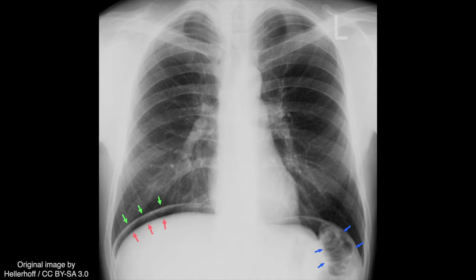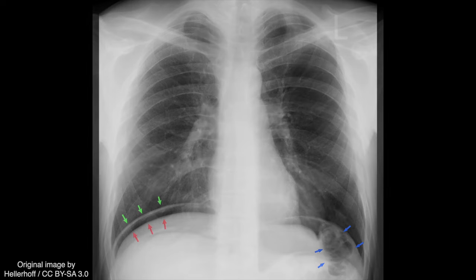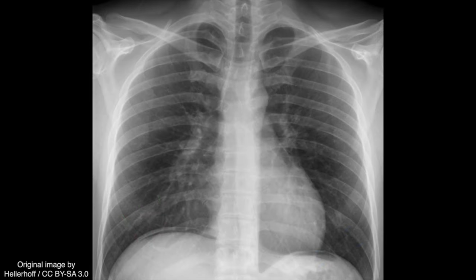Pneumoperitoneum refers to free gas in the peritoneal cavity, and it appears on an erect chest radiograph as a subdiaphragmatic lucency. The green arrows demarcate the right hemidiaphragm, which appears as a thin white line. The red arrows demarcate the upper border of the liver, and between the liver and the right hemidiaphragm is a thick crescent of air. Sandwiched between the blue arrows is a portion of gas-filled colon, with free air under the left hemidiaphragm adjacent to it. In a less conspicuous case, the thin area of increased blackness between the diaphragm (highlighted in purple) and the liver is the subdiaphragmatic air (highlighted in blue).